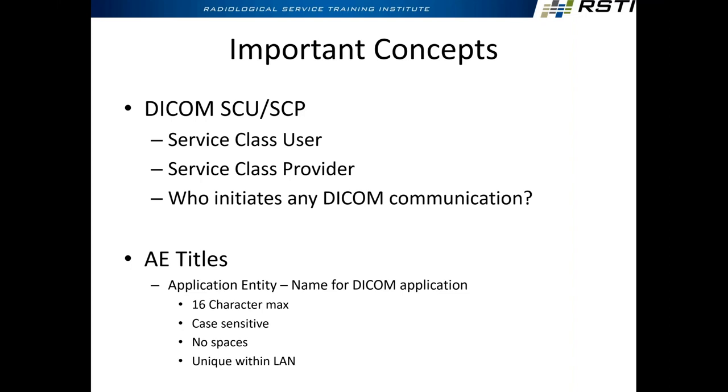So from a DICOM standpoint, everything we do, RIS, worklist, storage commit, print, everything is done in this SCU, SCP relationship. Who initiates it every time is the SCU. The SCPs are just servers. They're PACS, they're RIS, they're worklist, the devices sitting on the network, waiting for an SCU, waiting for a client to talk.